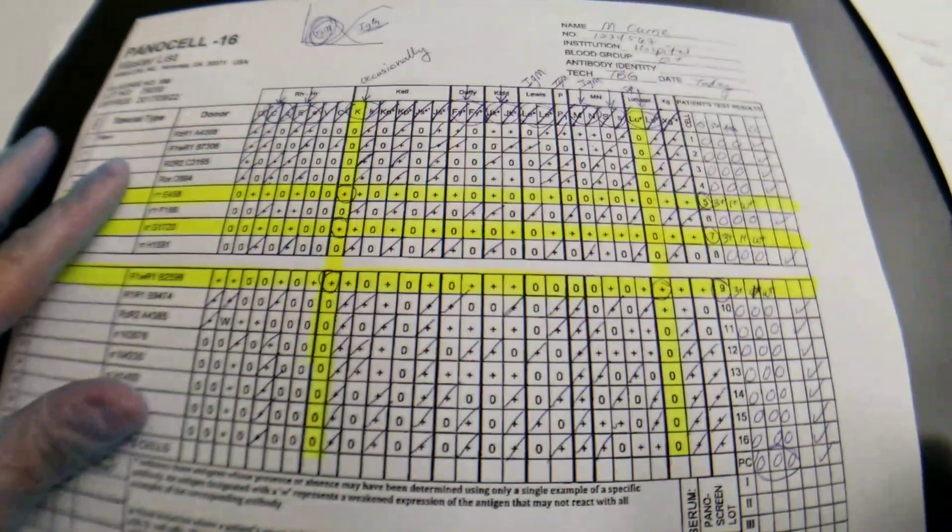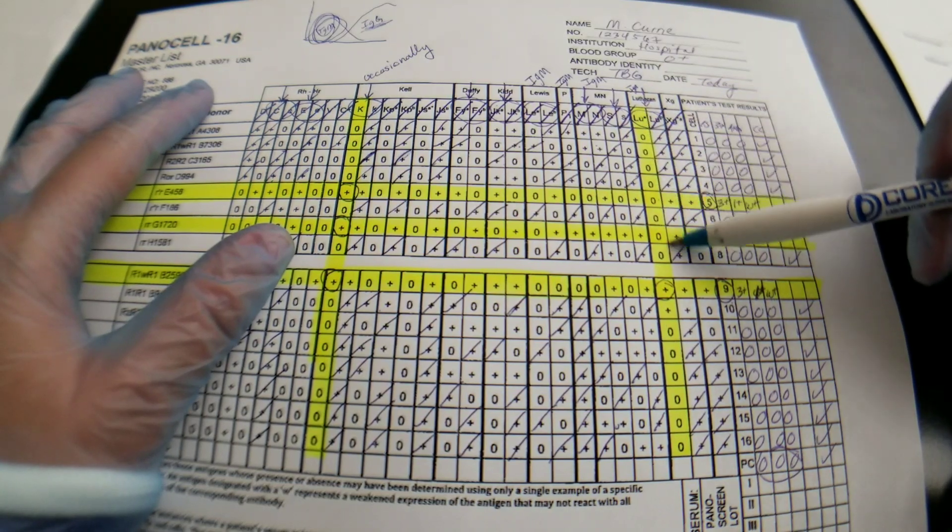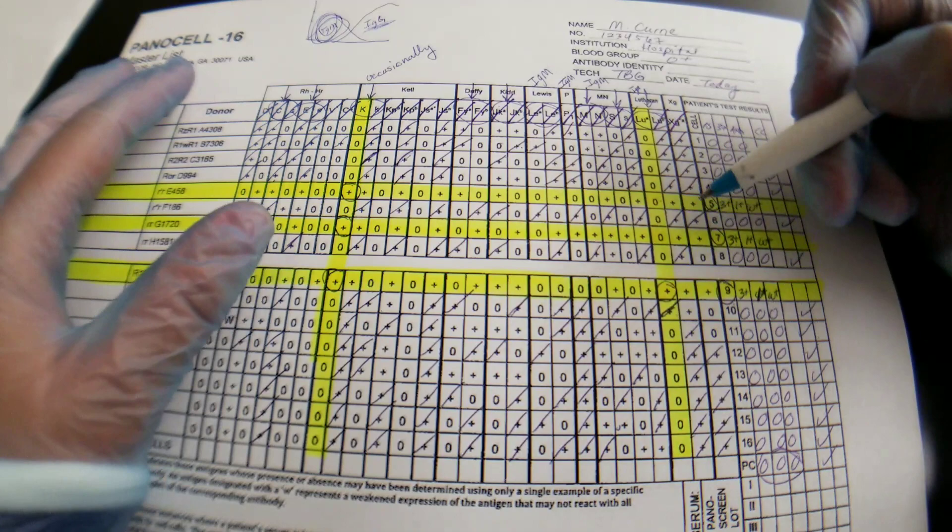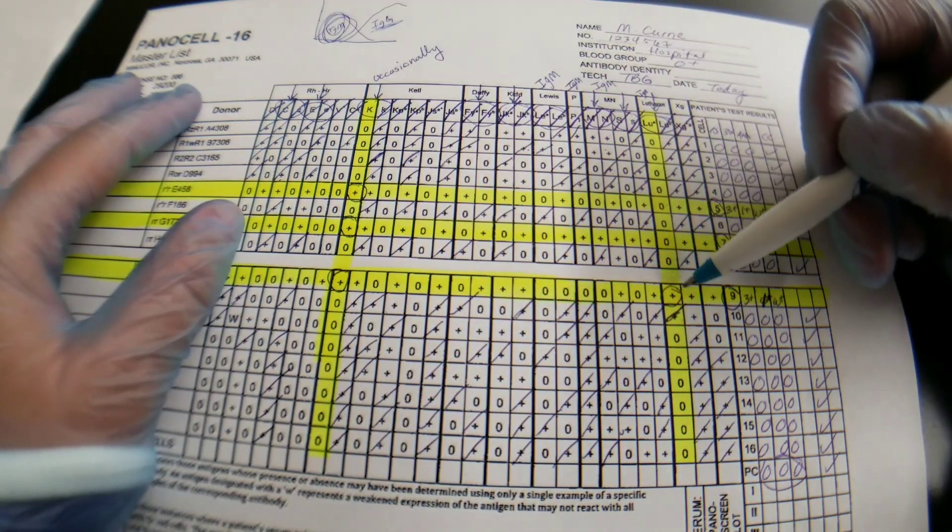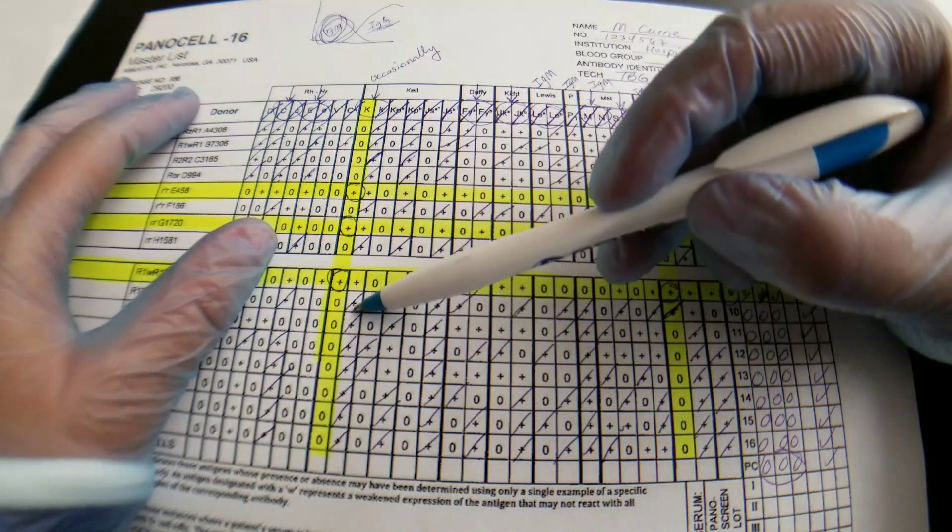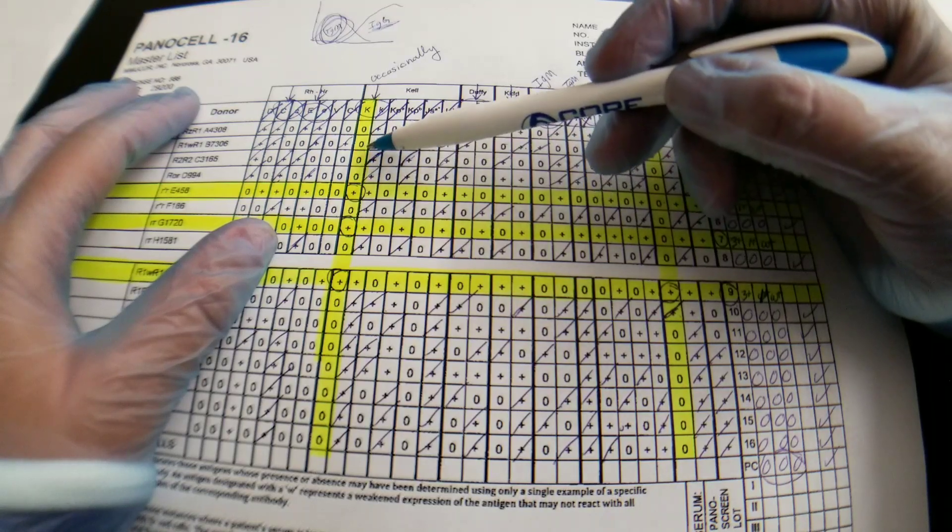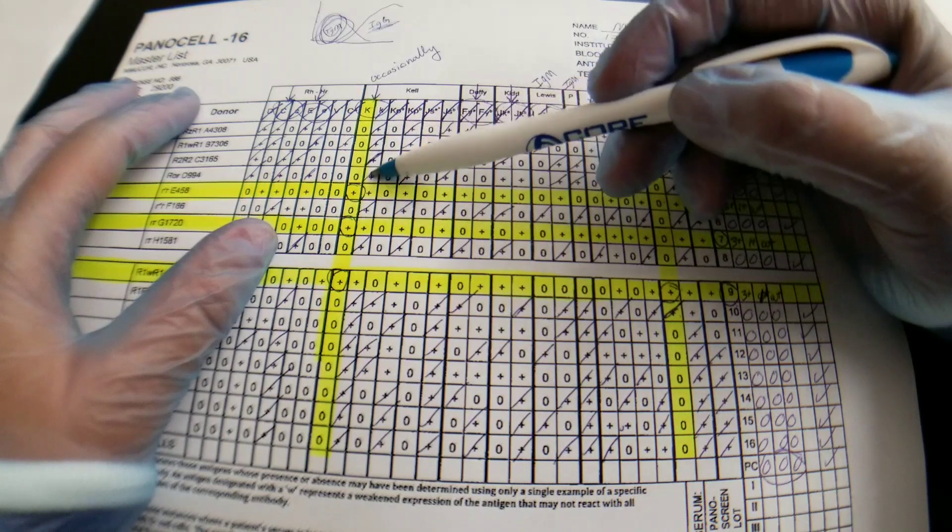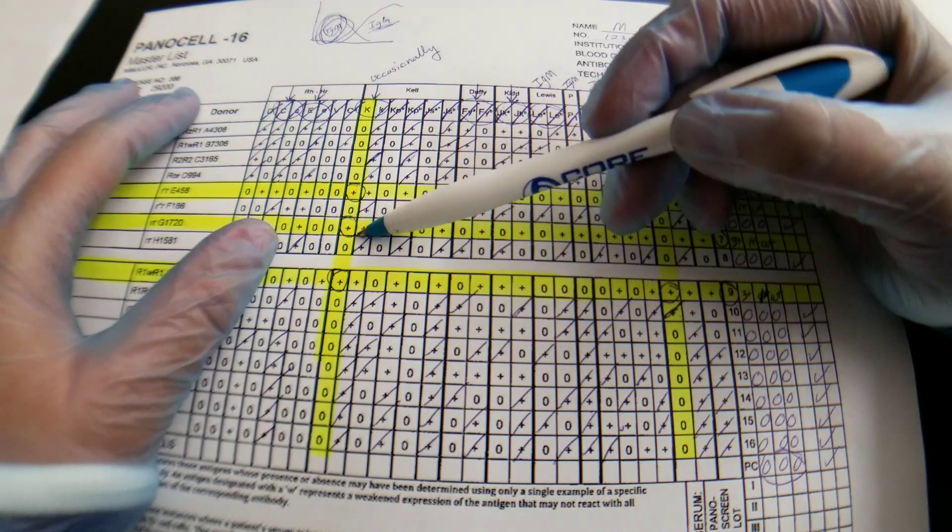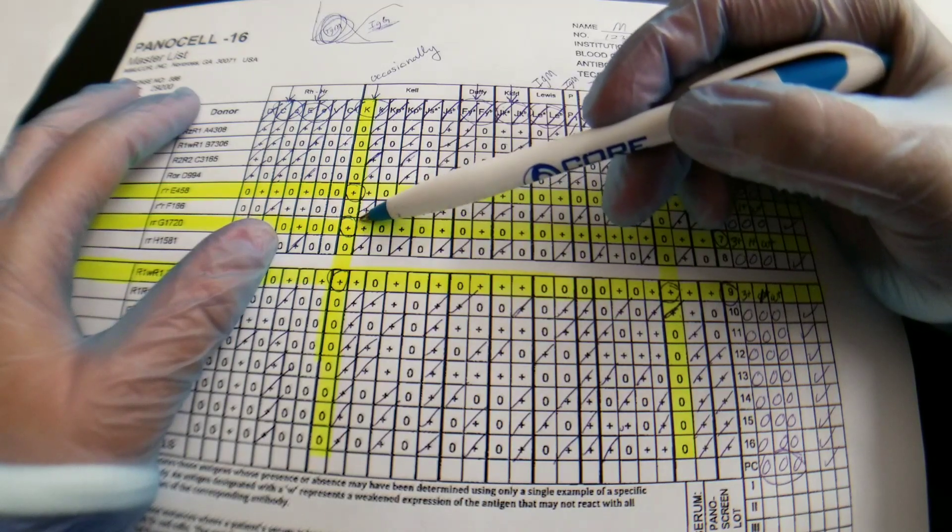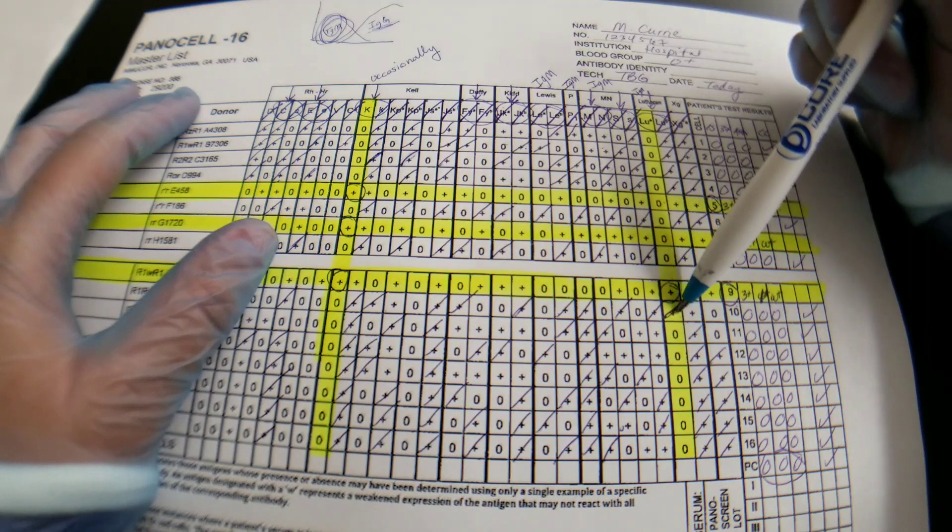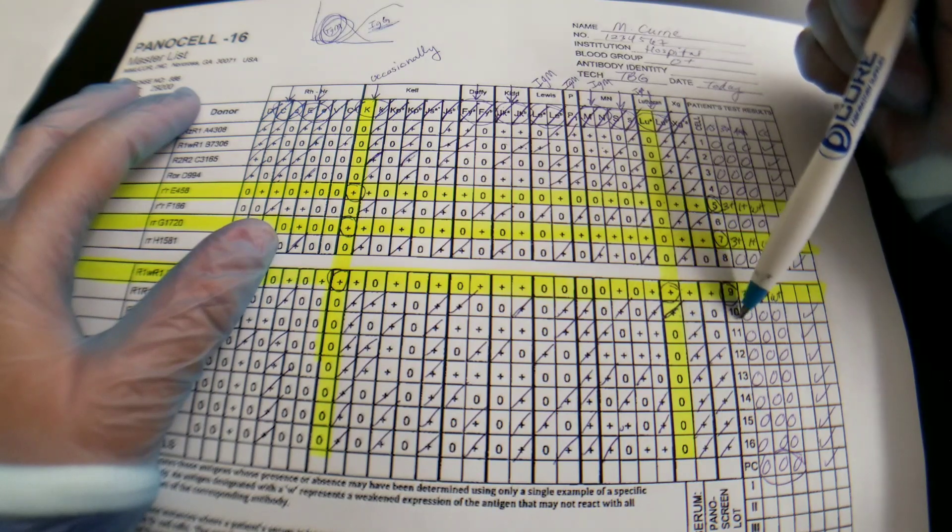So I did, for just practice sake, I did not rule out the Lutheran A here, because it was heterozygous in the negative, but you can honestly do that, because it's very rare to see it where it is not heterozygous. The same thing with Kel, usually see how many positives there are, as opposed to negatives of this antigen. Most people do not have the Kel antigen, but they do have Cellano. So in order to rule this out, in single exclusion would mean that you wouldn't be able to have it in a heterozygous format, which is what I was talking about over here. Same thing. This is very rare to have that antigen. So the fact that they did have the antigen only when they had Lutheran B, I can rule this one out because it was in the negative.